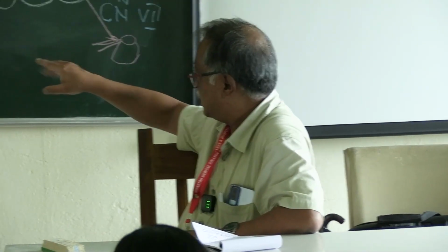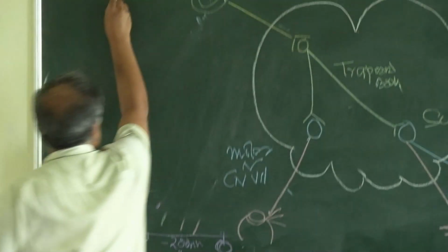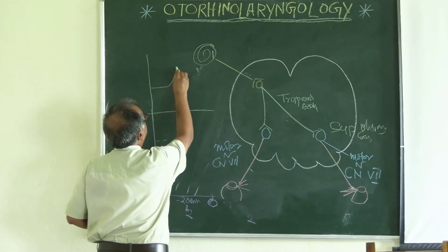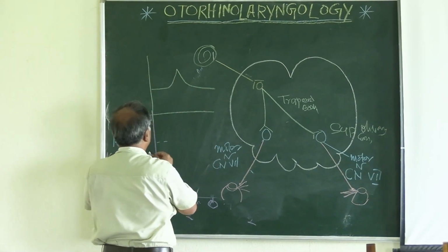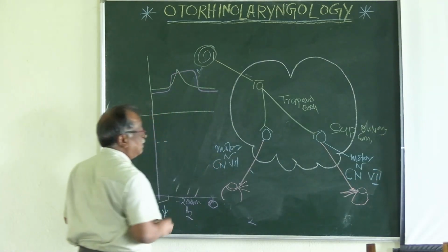When you take the graph of the compliance, suddenly the stapedius muscle will contract and then fix the whole ossicular chain and tympanic membrane, and there is a peak or a curve will arise. That will give the sign for the stapedial reflex. Suppose the curve is going like that. The stapedial reflex may be like that, or sometimes the stapedial reflex may be like that.